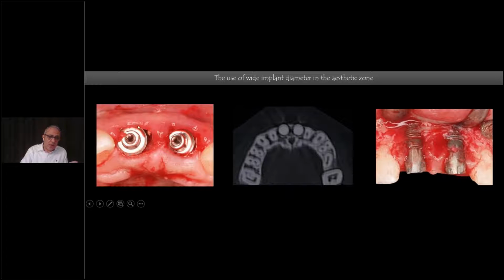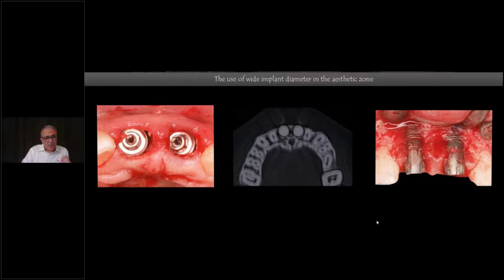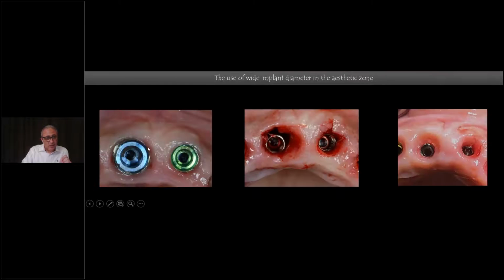The closer you get to the inner surface of the labial plate of bone, the more you lose bone right away. That's something that we know for sure. Look here, I always see cases like that, and I don't think twice to remove these implants because these are failed implants. I remove the implants and exchange them with narrower diameter implants. Now I can have a labial tissue bulk.